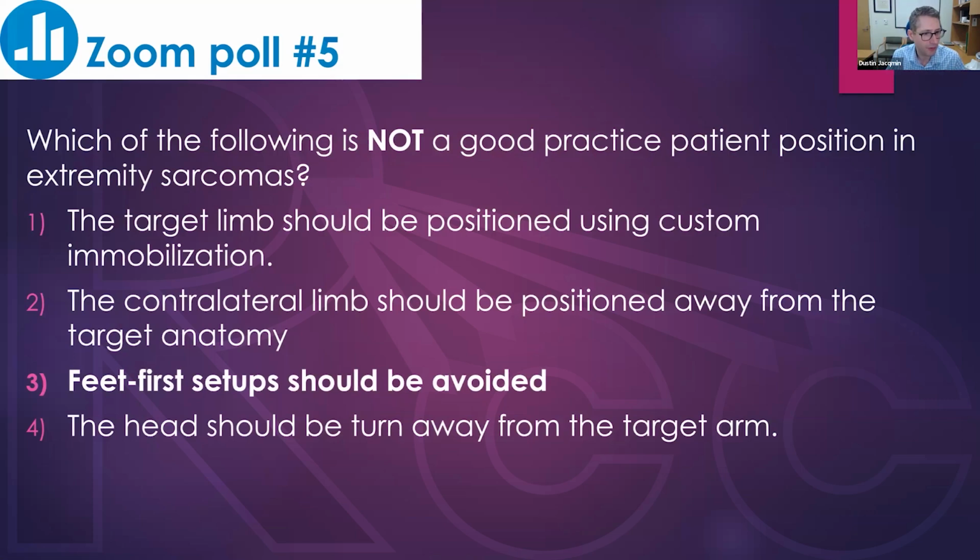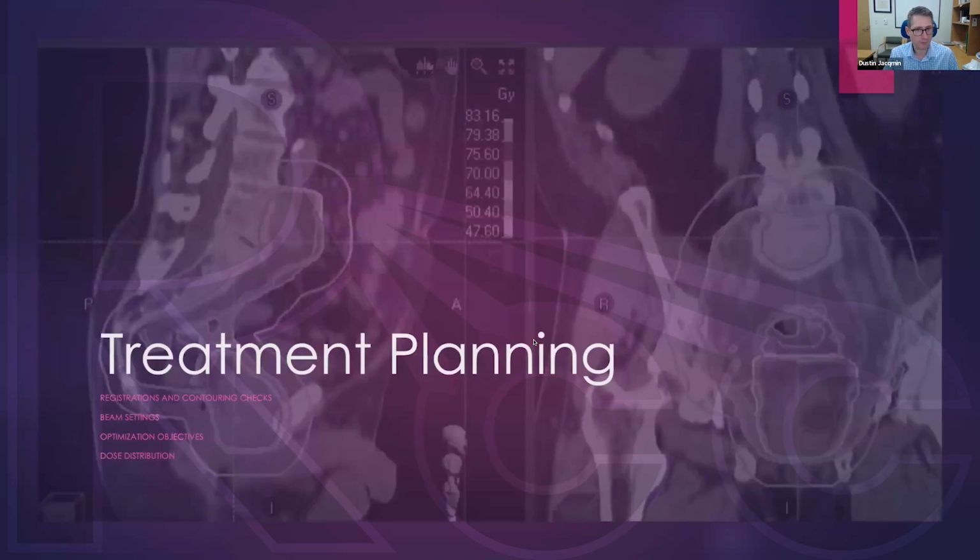So the correct answer here is feet first setups should be avoided. This is not a good practice. Feet first setups are essential to treating the lower leg as part of a sarcoma practice. So there you go. Just a quick question about the extremities.